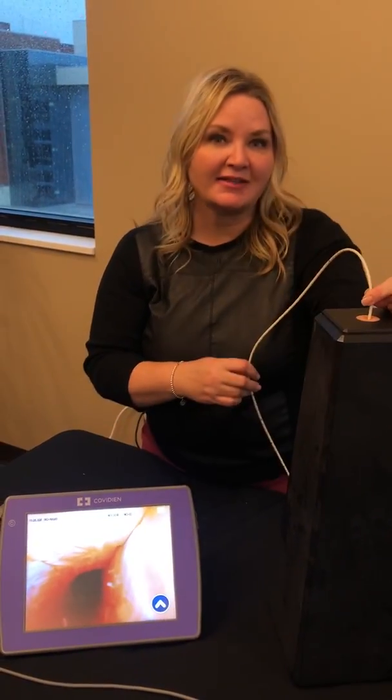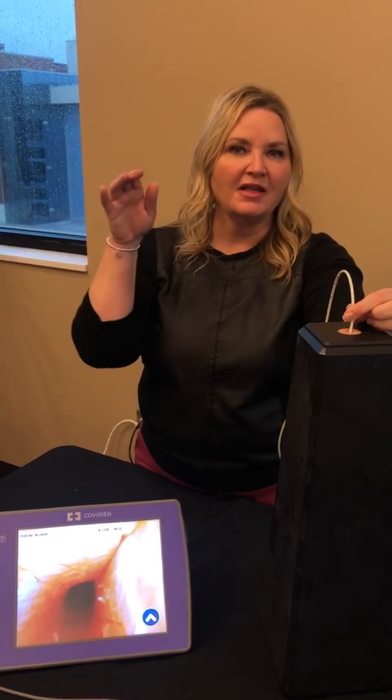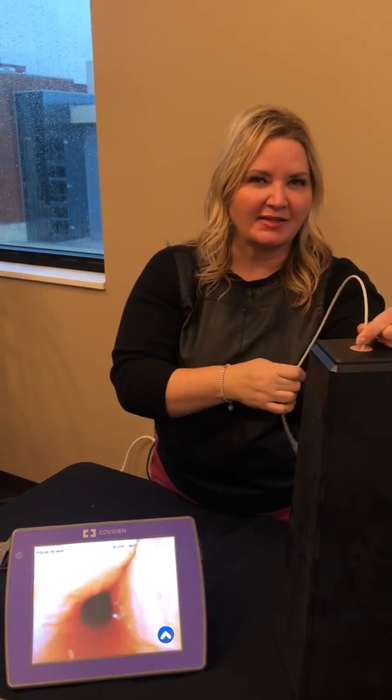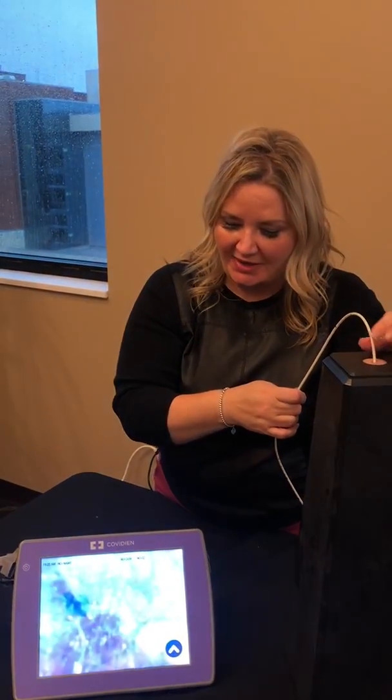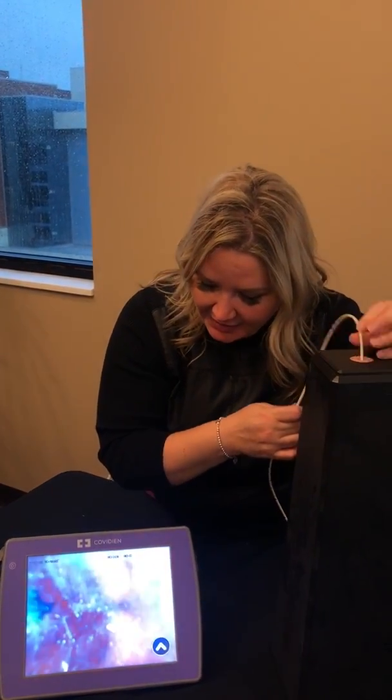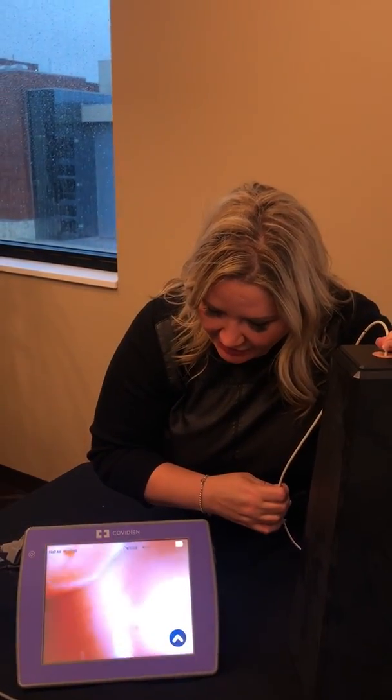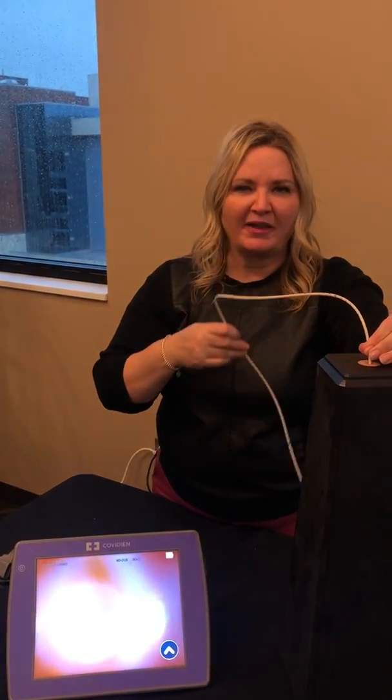In the esophagus, you're going to see some kind of smooth muscle, and you might even see some peristalsis of the esophagus itself. We're going to keep advancing until we get into the stomach. Once you get into the stomach, you'll start to see more ridges and ripples of the stomach. And so how is our placement looking now?